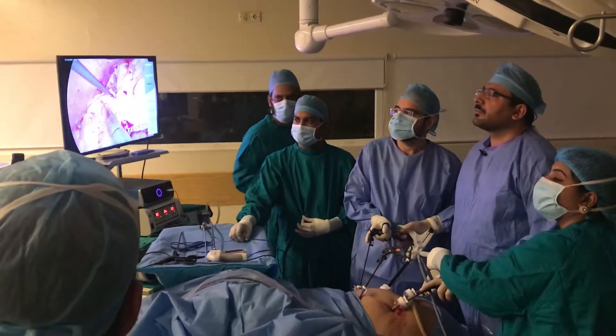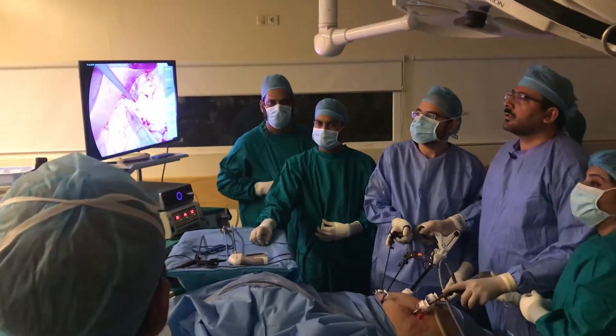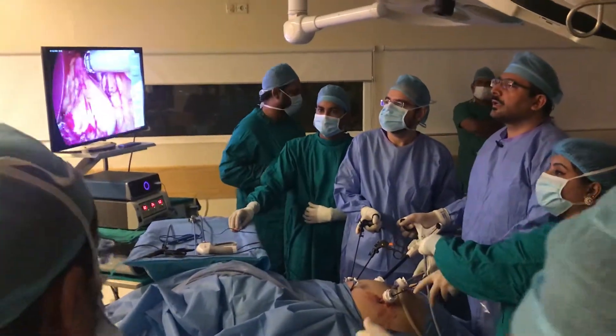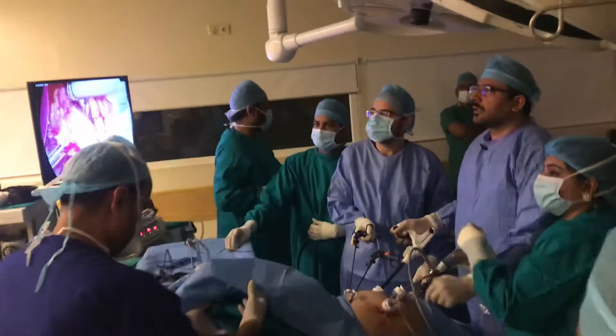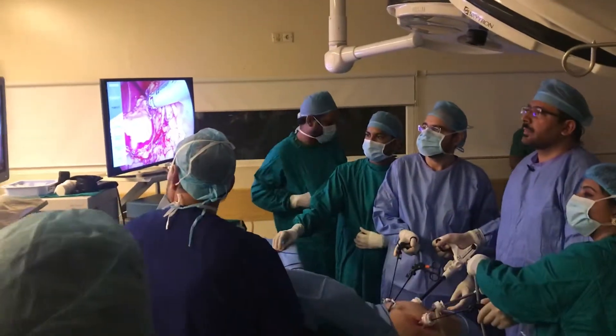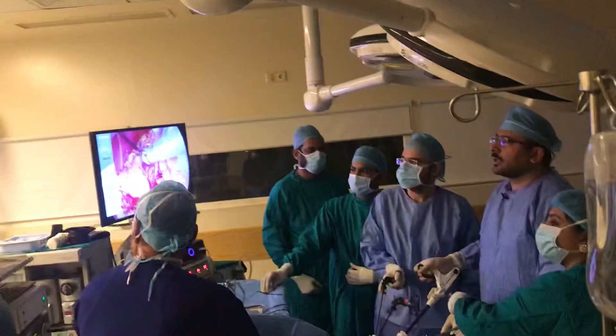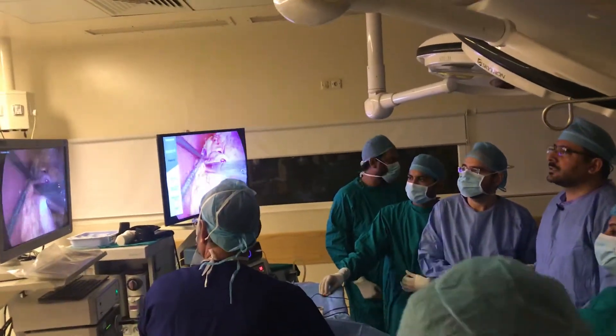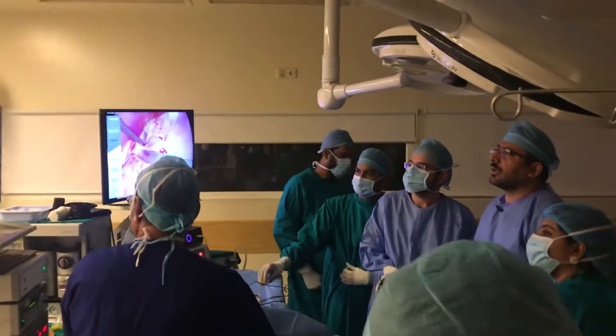Just move the bougie. We can see here — yes, this is the pouch, and we are measuring the lumen.